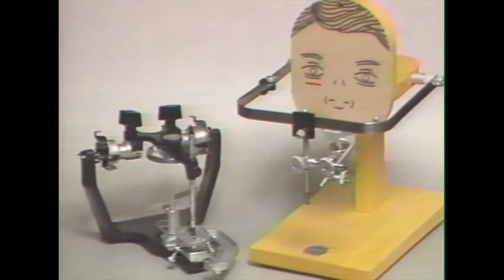We hope this videotape is an aid in understanding the advantages of using a Facebow and a semi-adjustable articulator. The Hanau spring bow and modular articulator provide simple, easy-to-apply instrumentation for simulating jaw movement. Their wider application will result in prosthodontic restorations, which are better adapted to the individual patient's mandibular movements and fewer chairside adjustments.